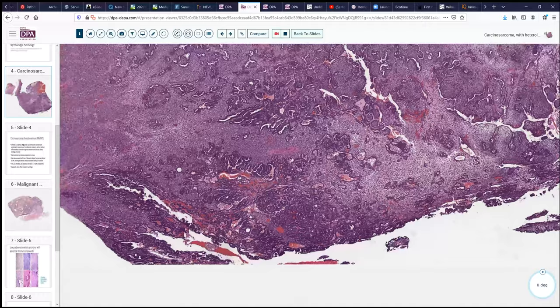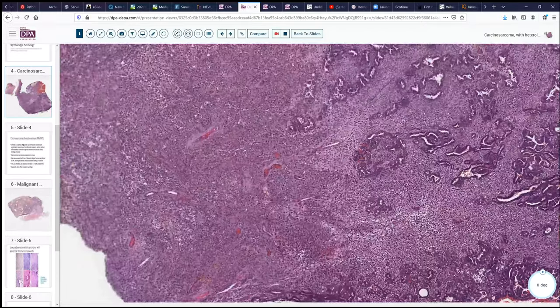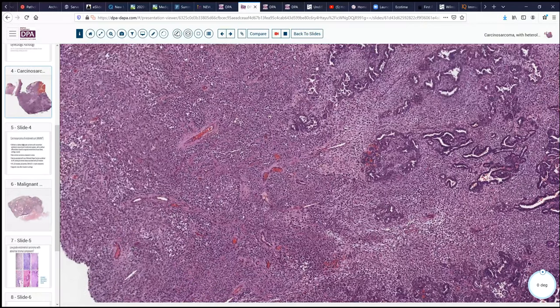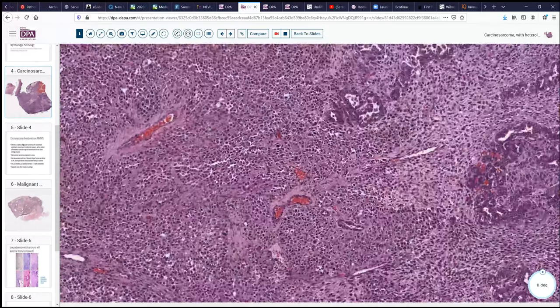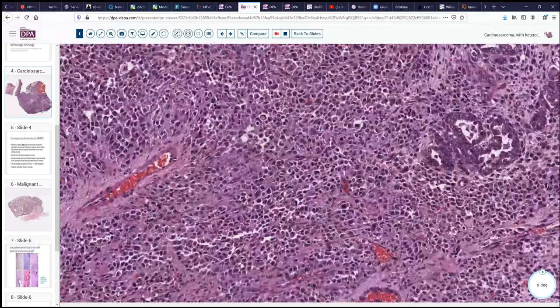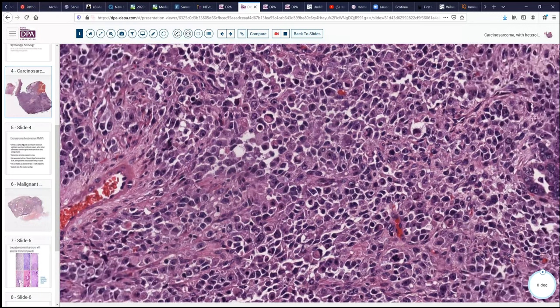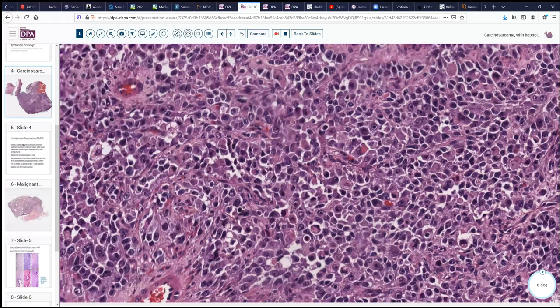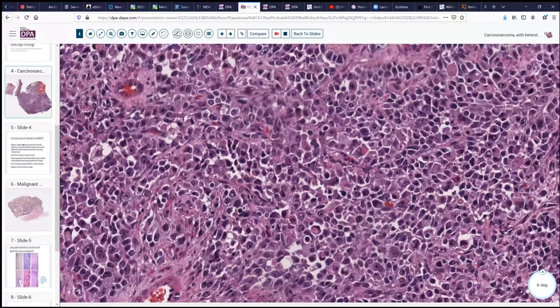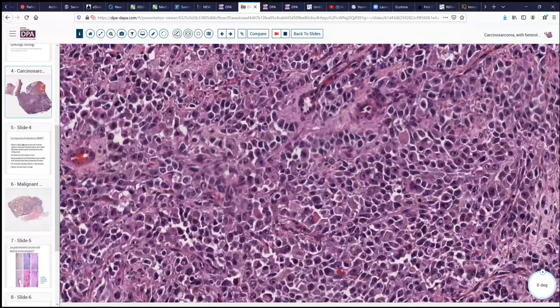Looking a little bit further, in other areas we have a somewhat different morphology. We go from well-defined glandular structures to more undifferentiated tumor with block-like cytoplasmic contours. Again, very high NC ratio, malignant appearing nuclei, and fairly frequent mitotic figures or apoptotic bodies.